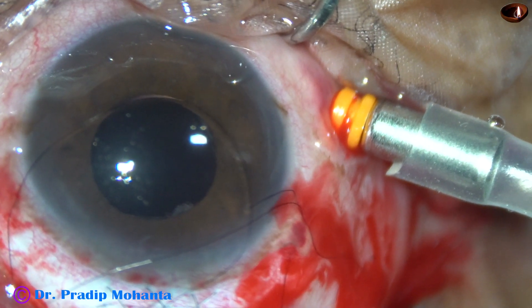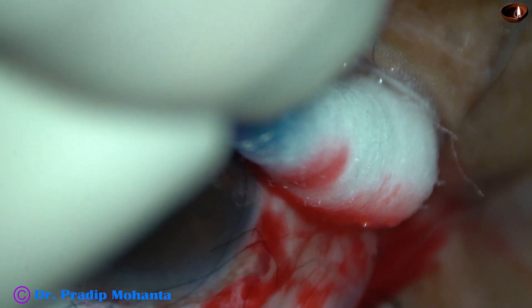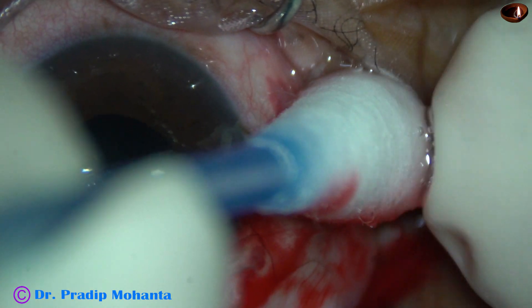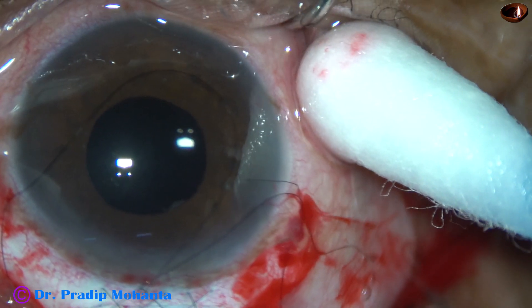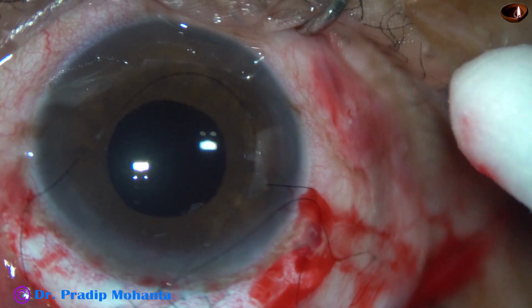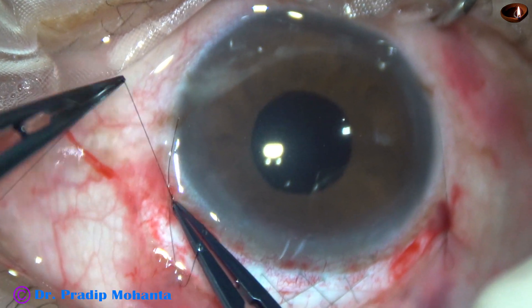Now I am going to pull the trocar — the irrigating trocar — out, and massage the area with a cotton-tipped Jensen bud. Keep it pressed for a few seconds. As I remove the bud, I find that the tunnel is closed, so no suture is required at this site.